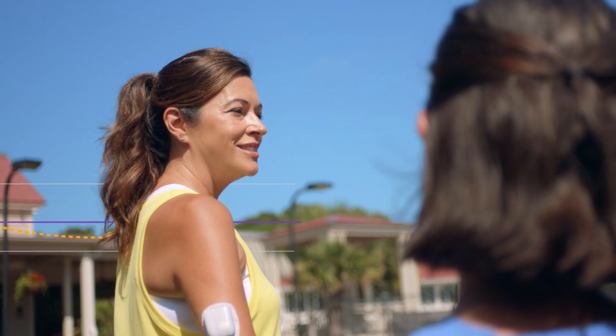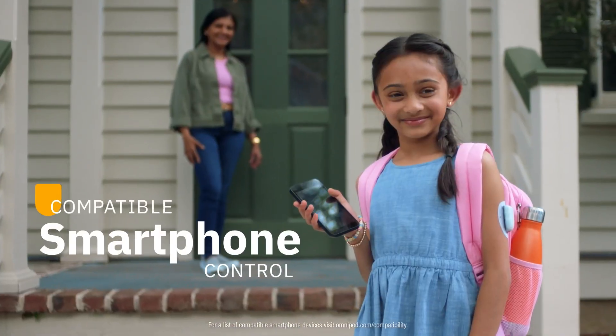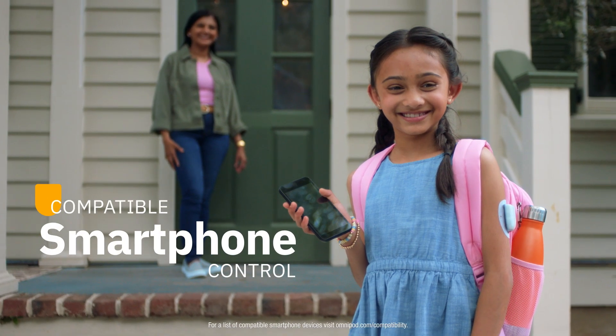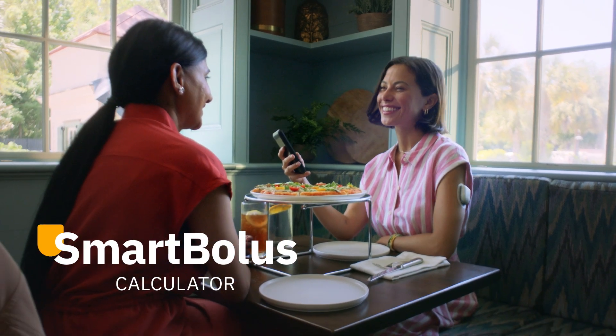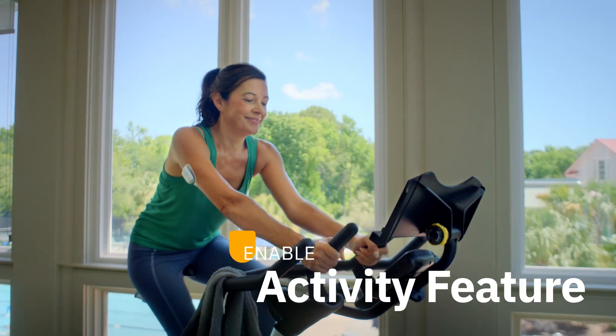The pod stays at work while you live your life. Even better, everything can be controlled from a compatible iPhone or Android smartphone. The Omnipod 5 app features helpful tools like the Smart Bolus Calculator for meals and the activity feature for exercise.